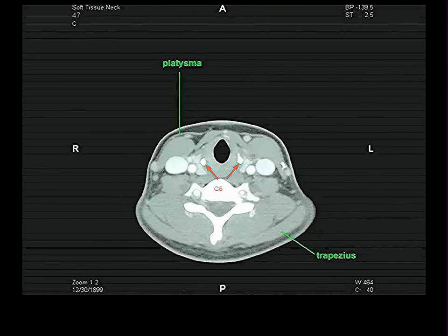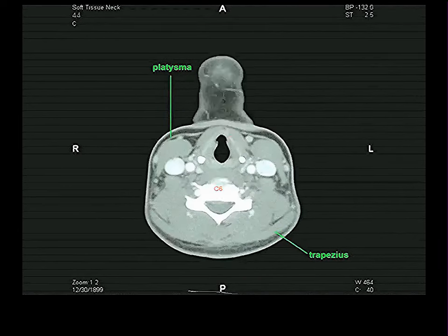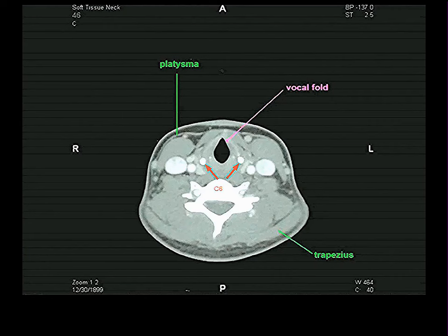She must have calcified, these must be, I don't know what the hell they are. Let me go. Yeah, there's nothing these could be other than inferior horns of the thyroid cartilage. I mean, you can almost see a thyroid cartilage here, right there. These must be her inferior horns and back wall of the lamina. They seem awfully radio-opaque, I must say, but I can't think of anything else they could be. So she may have some calcification in her thyroid cartilage.